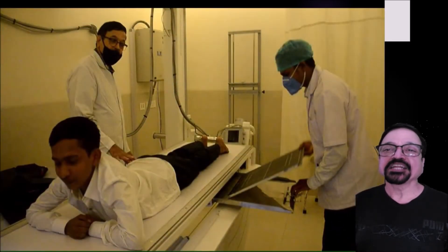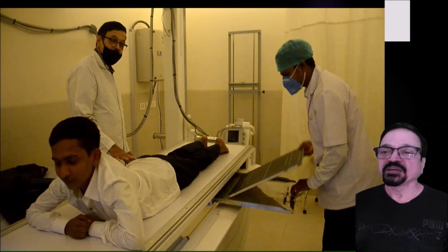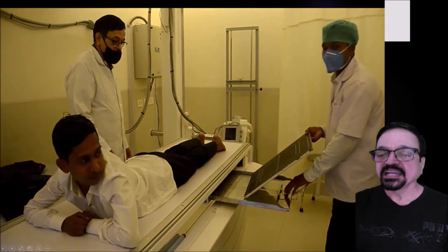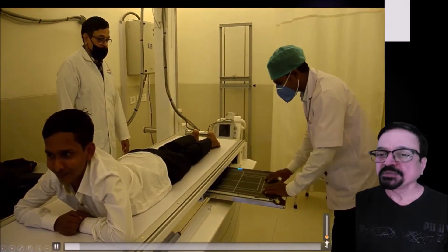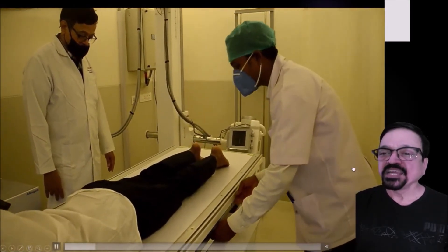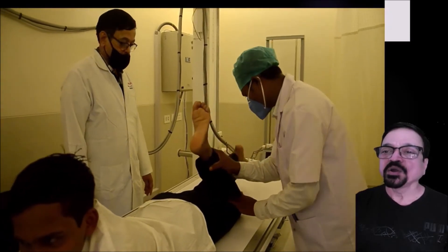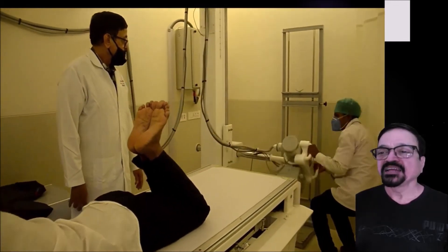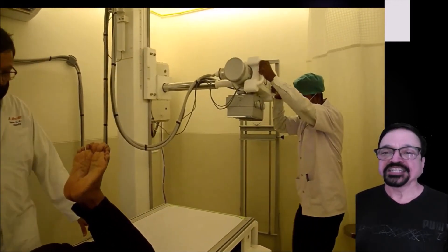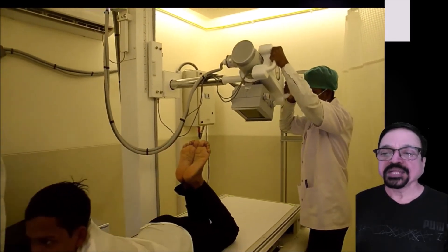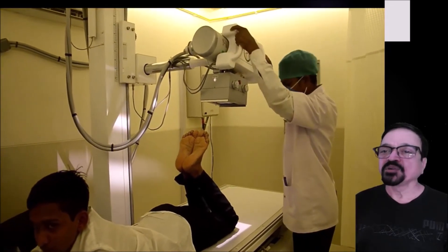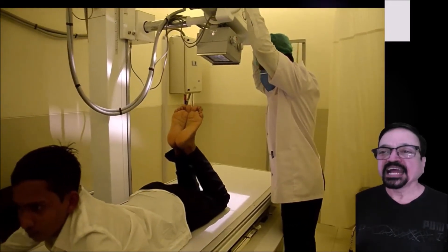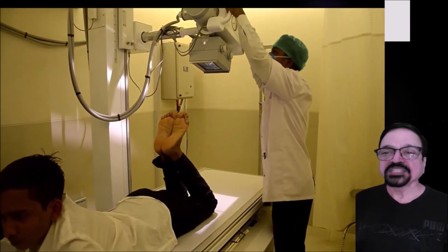Sometimes it happens that the patient cannot be in a supine position. This is another way in which the skyline view can be taken. In this method, the tube has to be positioned over the couch — that is, over the X-ray table. Tube angulation changes in this setup, but the basic principles remain: patient comfort is number one, and we must palpate the anatomical structures to confirm correct positioning and ensure it is feasible for the patient.